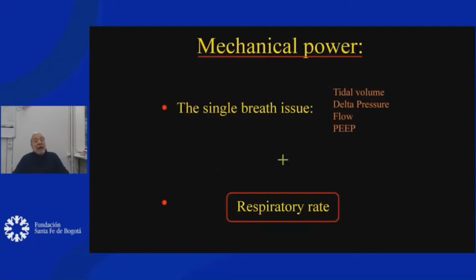Now, let's see, we have concentrated over years on the single breath. So we are looking at the tidal volume, the driving pressure, the flow, the PEEP. We forget the respiratory rate, because to damage something, we need energy. Energy is the product of the pressure and the volume. This is the amount of energy that we put in the respiratory system at every single breath.